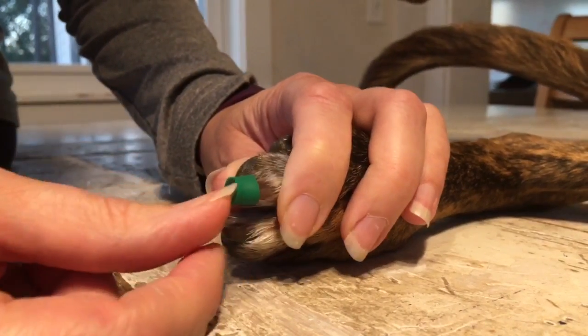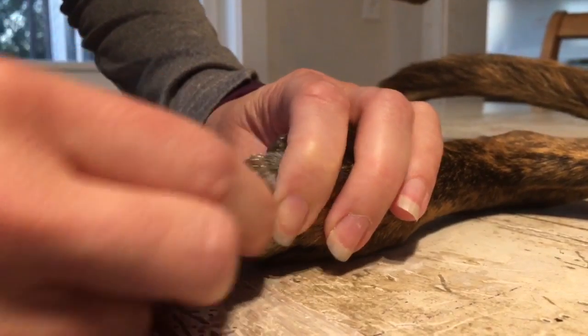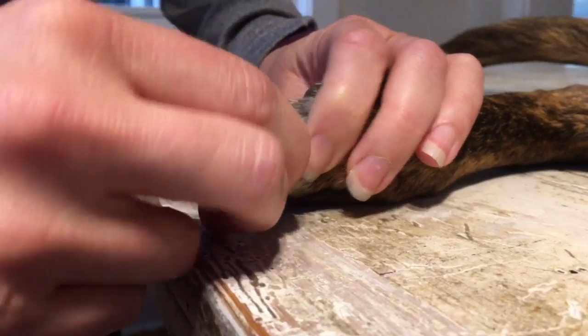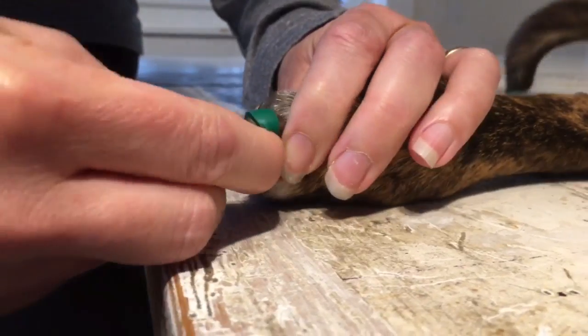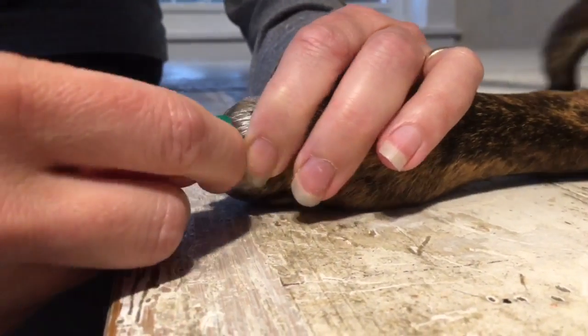Once it's on the nail, this is when I get to the working part. You can do this with fingertip or fingernail, and I'm just going to kind of see-saw back and forth — top to bottom, side to side — working the grip up the nail.